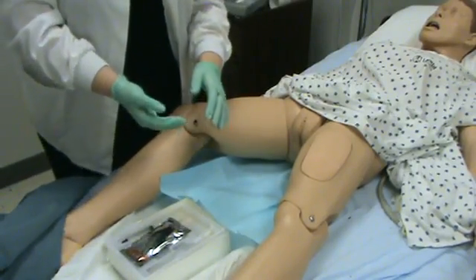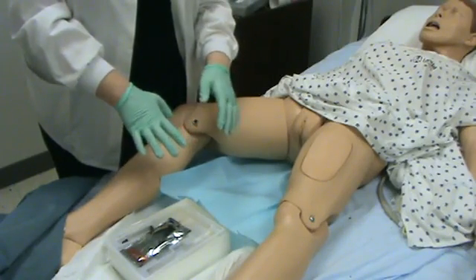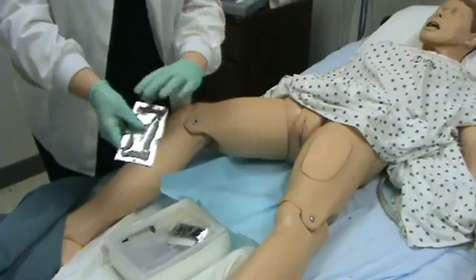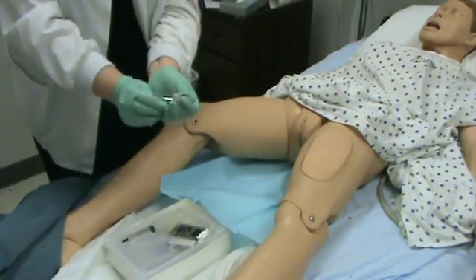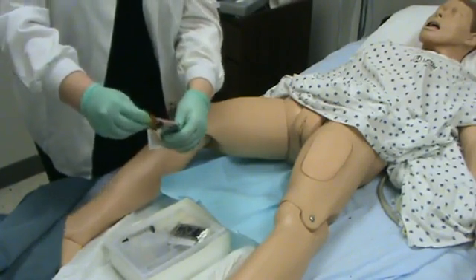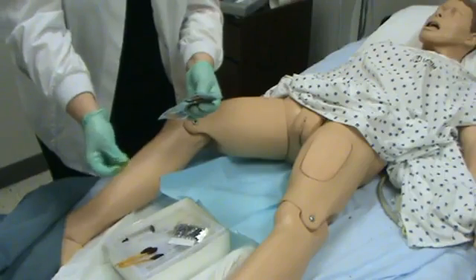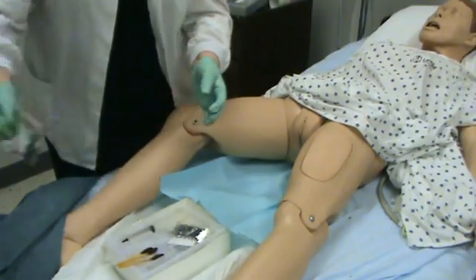Once you have sterile gloves on you must keep your hands above your waist. You will see me going off to my right side as I put my garbage into my bag. The kits will either contain povidone swabs. If I was going to use these swabs, I would remove them and lay them here so that they were easily accessible. If you get some betadine on your fingers, you just need to rub your fingers together for a minute and that betadine will dry. Then I am going to throw that away.